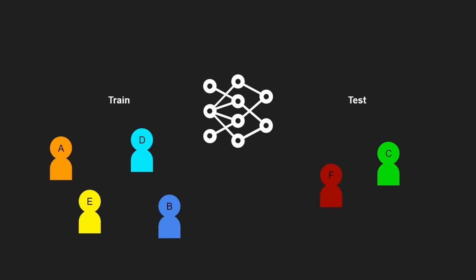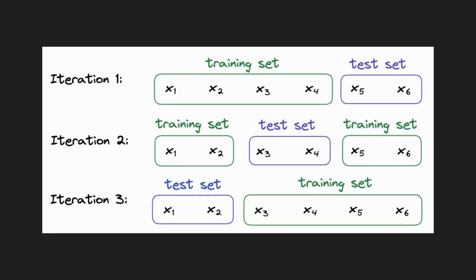This ensures that the model will never see a patient's scans in both the train set and the test set, meaning it can safely train on the data provided without the risk that it sees a scan in both sets. This process is referred to as leave K out or leave several out, where the majority of the patients are dedicated to training, while a certain number of patients, in our case 89, are left out each time the model is trained.